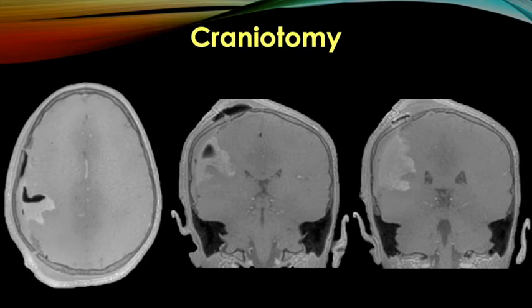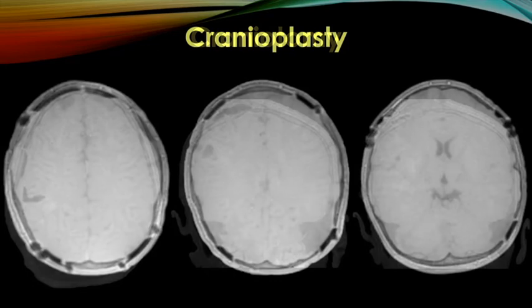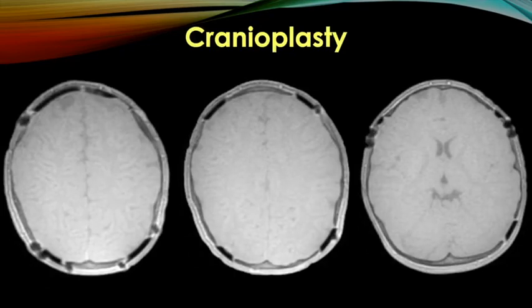In the post-craniotomy setting, ZTE can be a very useful alternative to CT. You actually get very good bone detail of the craniotomy defects, the different tissue properties of air, blood, complex fluid, and even the hardware, plates and nails, with minimal susceptibility. This is a PEEK, or polyether ether ketone, cranioplasty, and you can see the dark signal in the areas of the implants, as well as some of the transfixing nails, again with pretty minimal susceptibility, so very comparable to CT.